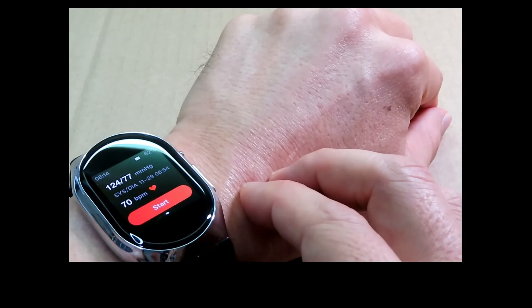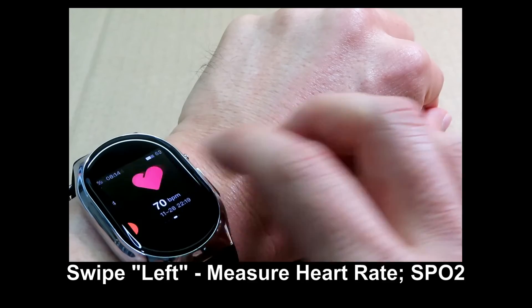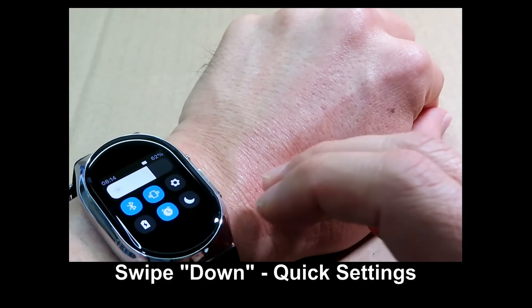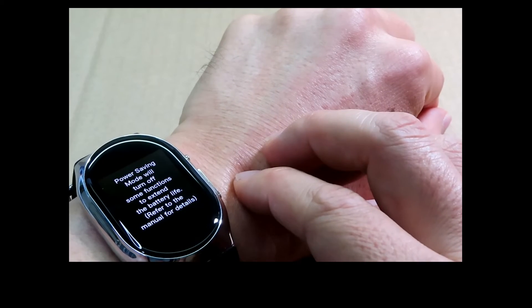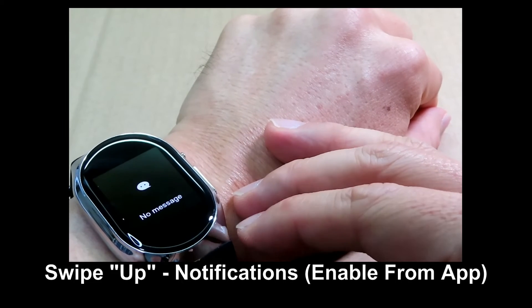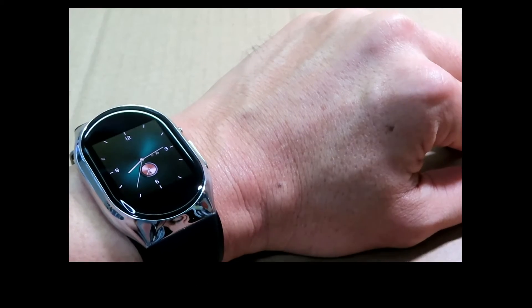From the main menu, swipe to the left to see the menus including oxygen saturation and the day's statistics. Swipe down to get to quick settings where you can set your alarm or go to power saving mode for your battery. You can set notifications for incoming messages — that is done through the app. That's pretty much the watch and its functions.